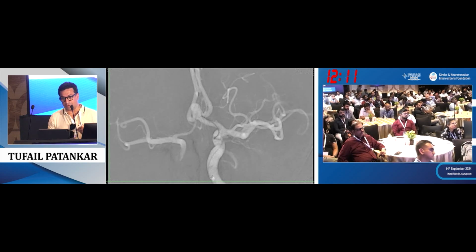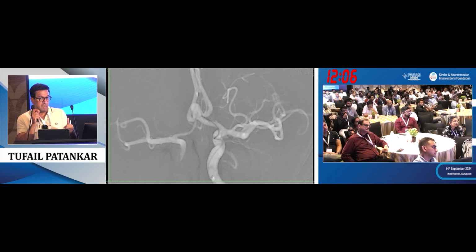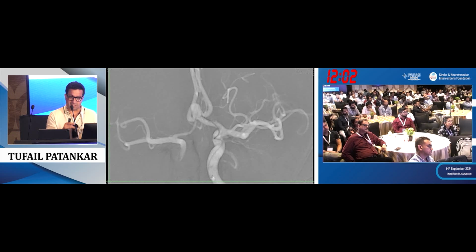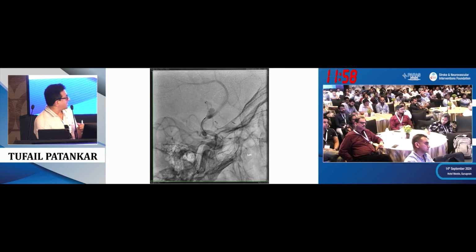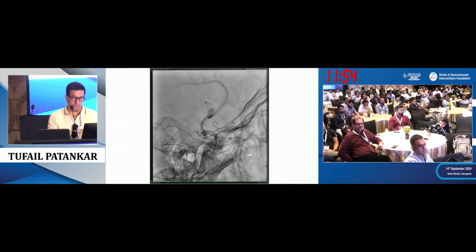And I have seen one case which I was proctoring. I forgot to tell the person to push it and give the stabilization, and tested, and the device came after the detachment into the MCA. So be very careful. As you can see now, you got good wall opposition. Make sure you got wall opposition. If the device doesn't touch the wall, the device will get pushed.